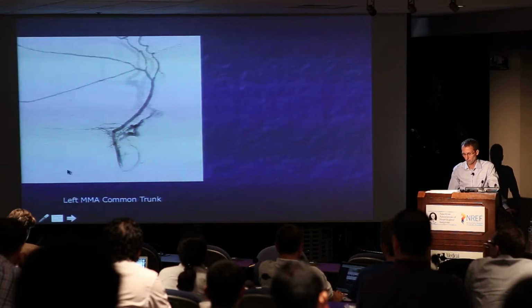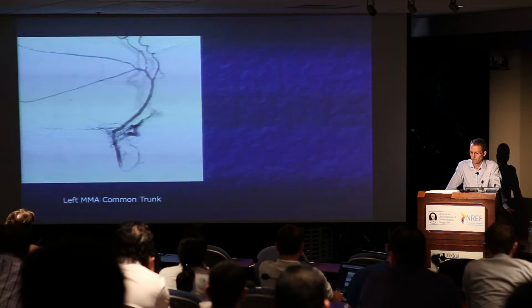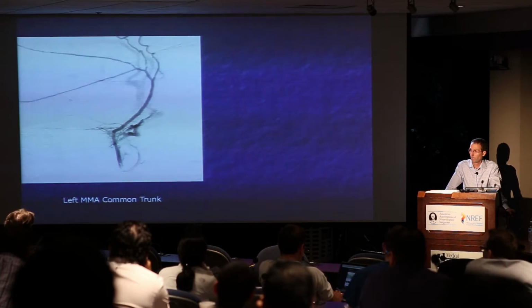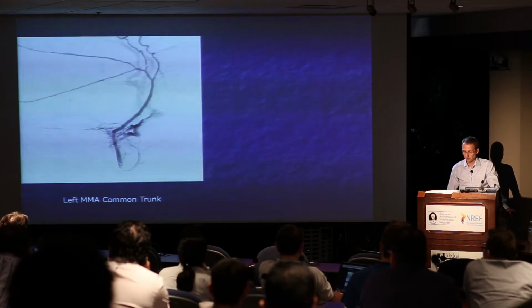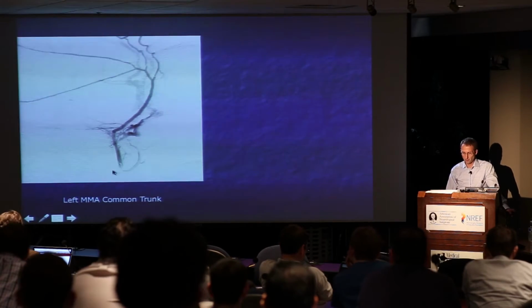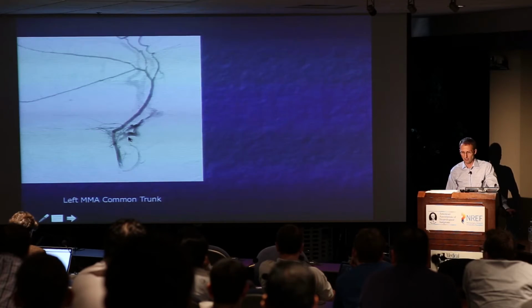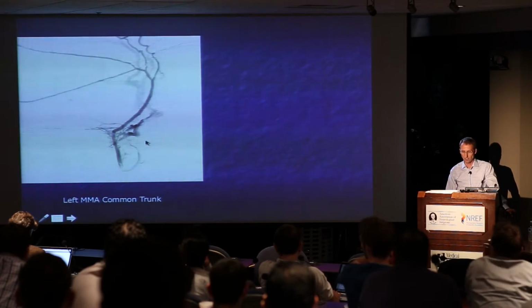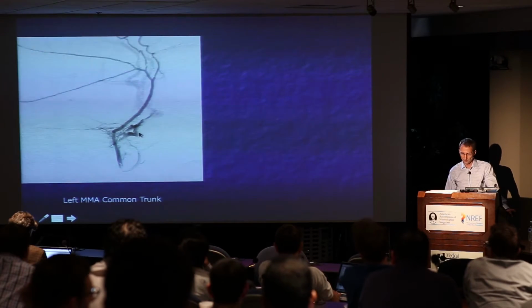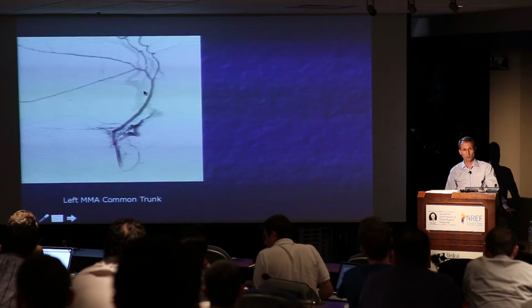One of the things you can ask yourself when you're analyzing this is what on that picture is artery and what is vein, and then start to narrow it down between those two routes into where the fistula is. Absolutely. So this obviously is the main trunk entering the foramen spinosum running forward, but there are tiny little branches coming off here. Then there's a caliber change right about in this location, where this is switching to the venous pouch. So the fistula has to be located more in here, and this more is that venous pouch in the sphenoid, ultimately running with the outflow to these cortical veins.